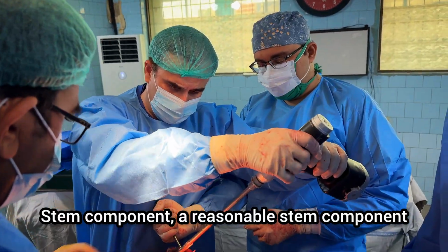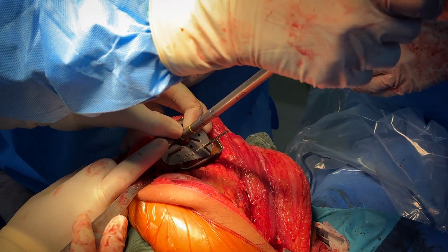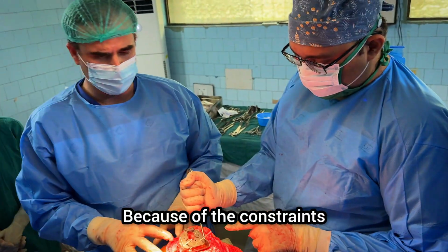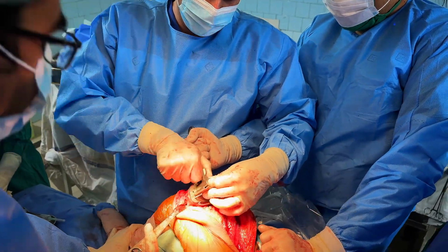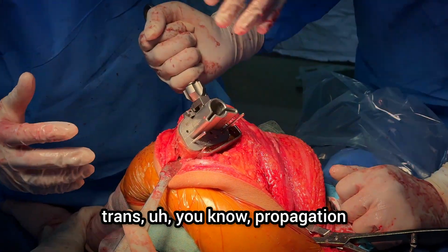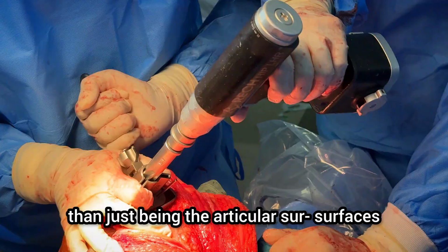A reasonable stem component here, as with other constrained implants, okay? Because of the constraints or forces that will result after we do a constrained hinge implant, we need force propagation, transmission to the rest of the bone rather than just being on the articular surfaces.